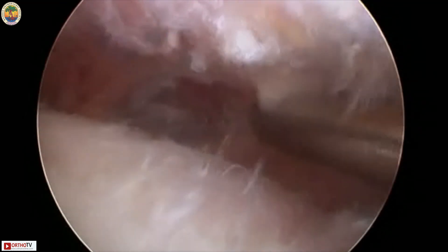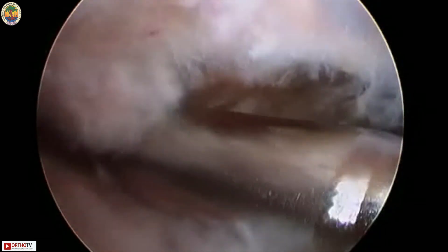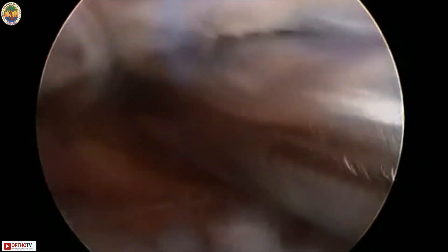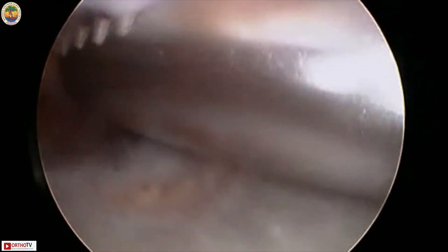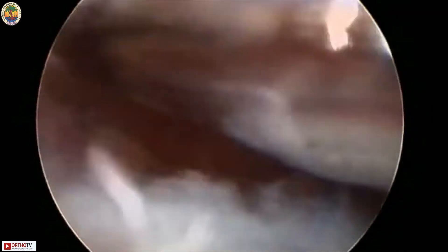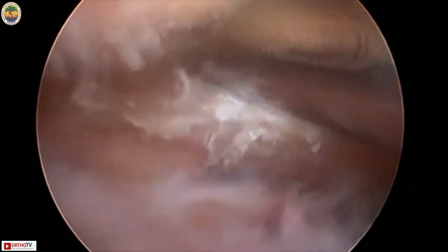We remove and shave the bursa at the inferior surface of the acromion until we reach the AC joint. We also remove the inferior capsule so we can clearly see the inferior border of the acromion and the clavicle. Our objective is to clearly visualize the anterior and posterior corners of the AC joint. We must remove the entire bursa and shave the entire inferior surface of the acromion and clavicle. Once you can clearly visualize the lower border of the acromion and clavicle, you know this step has been done adequately.